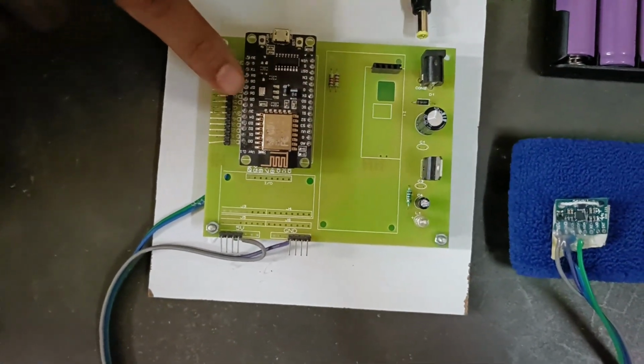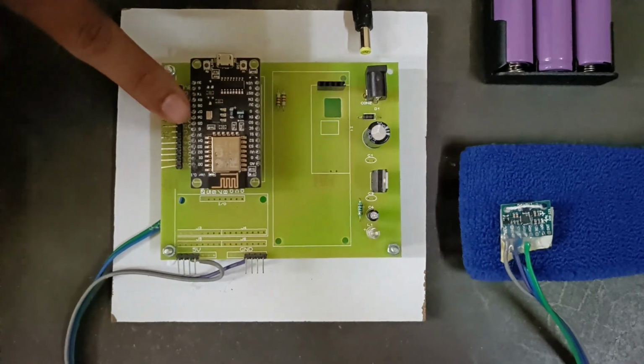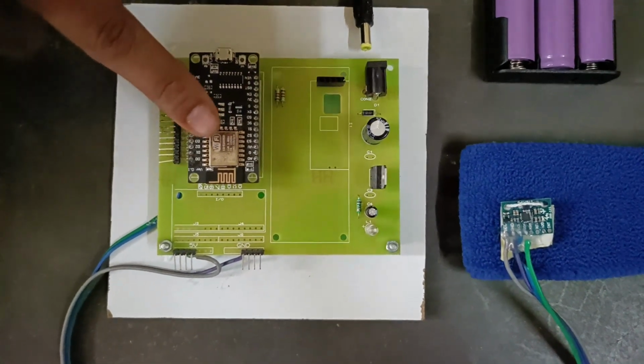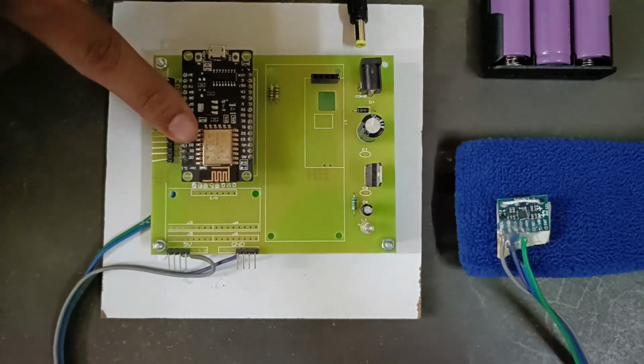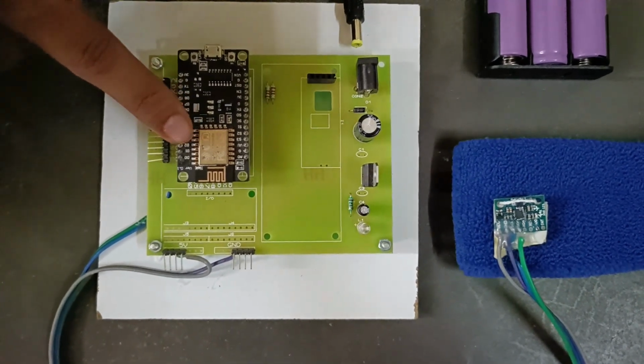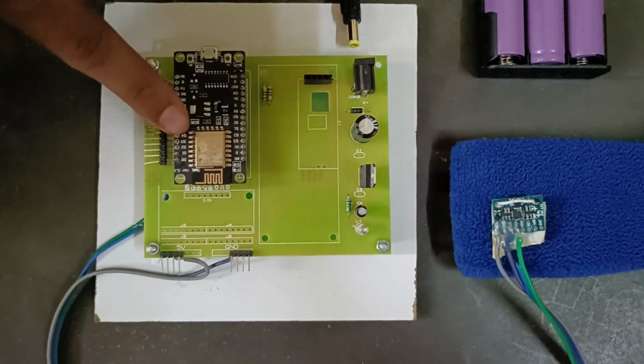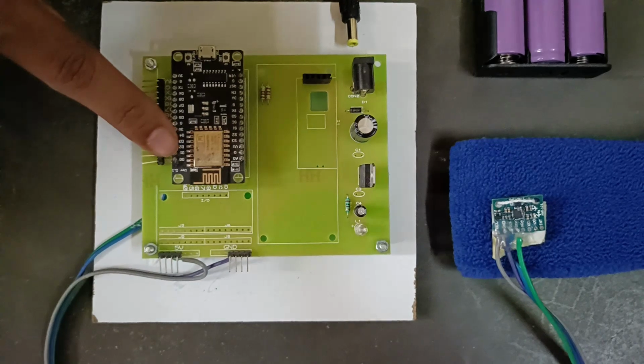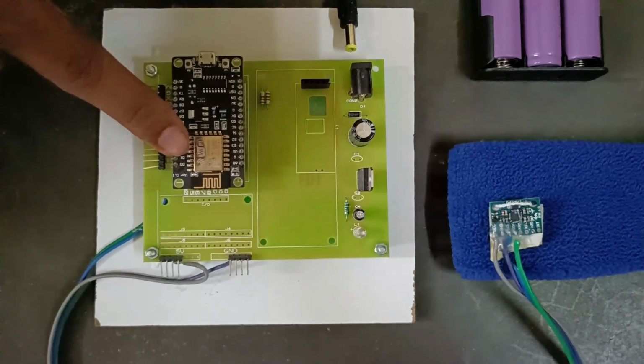It is a Node MCU ESP8266. It controls the entire transmitting section. It also sends the gathered data from the accelerometer to the receiving section, and also to the Blynk IoT application, a software application, through Wi-Fi.